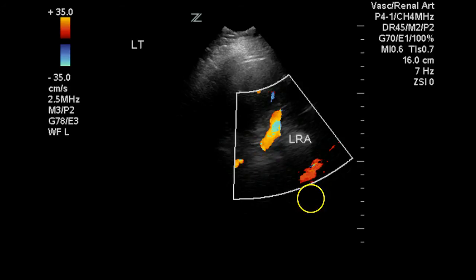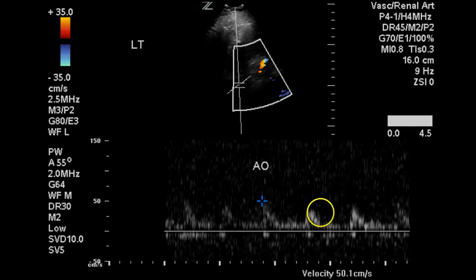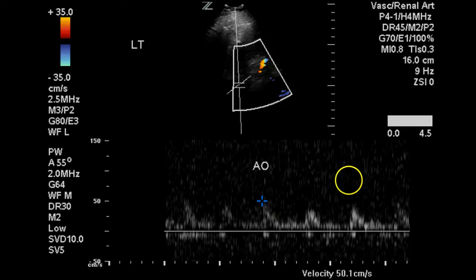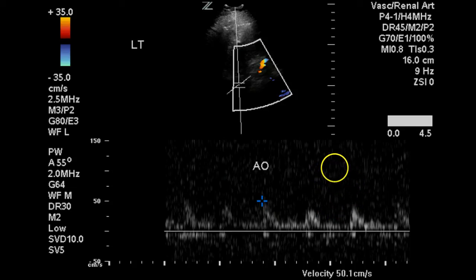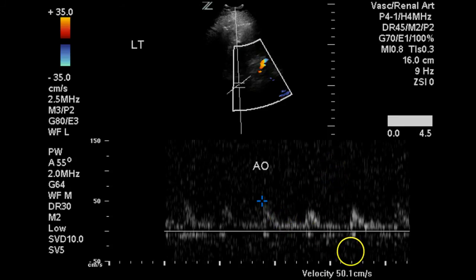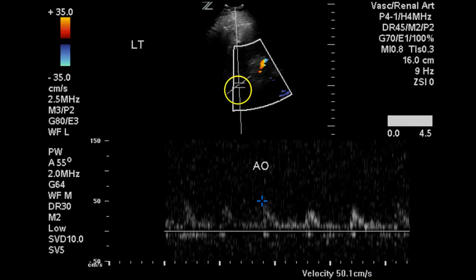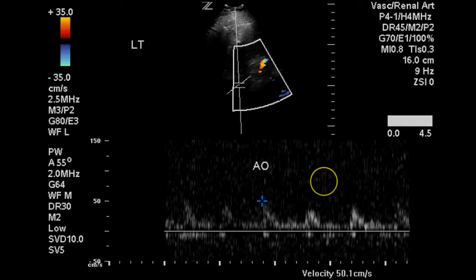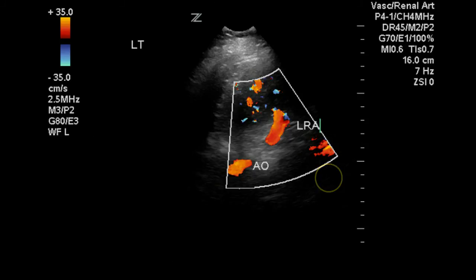Here is the middle portion of the left renal artery, which fills well with color. We are now looking at the aorta in an area near but above the origin of the renal arteries — we always want to measure above. It should be monophasic, and it is. We get a peak systolic velocity of 50, although it is hard to determine whether the angle is set correctly.